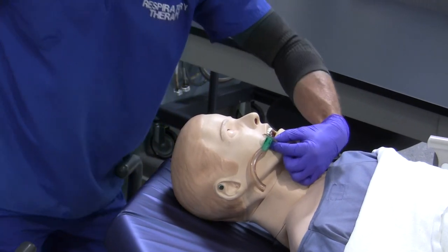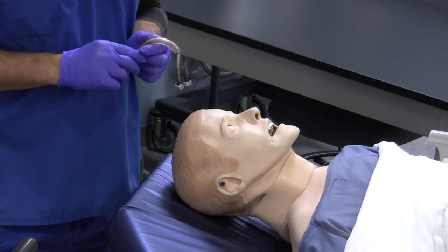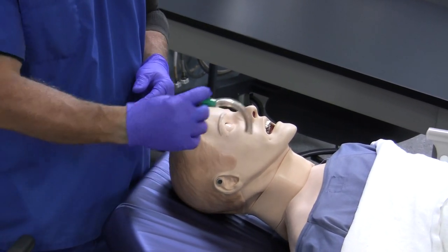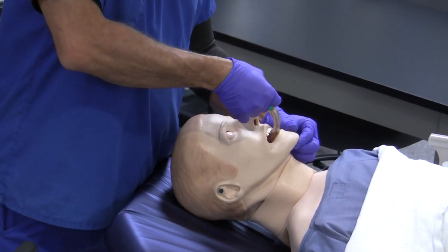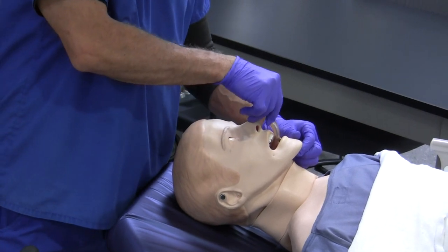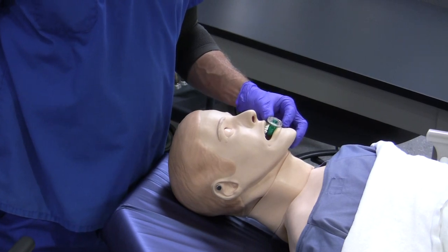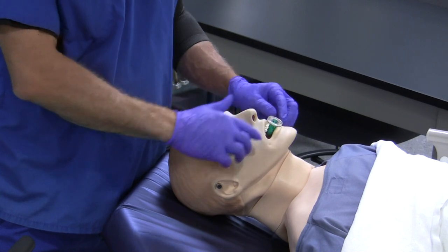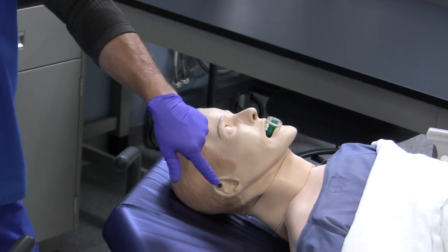Once the airway is sized, it needs to be inserted properly. Hold the OPA by the flange and place it upside down into the patient's mouth, running along the top of the mouth and feeling the hard palate. Once the hard palate transitions to the soft palate, rotate the device 180 degrees and continue to advance it until it stops. No need to force it — if it's the right size it should just wind up in place.